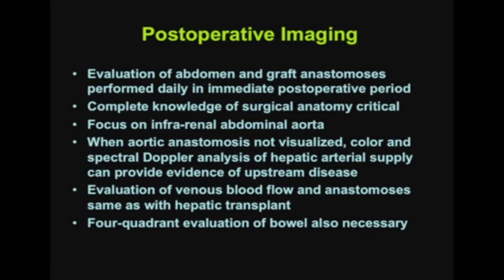Ultrasound imaging of the abdomen and graft anastomoses is performed daily in the immediate postoperative period. And once again, a complete knowledge of the surgical anatomy is truly critical to the success of the examination and the correct identification of complications when they do occur.